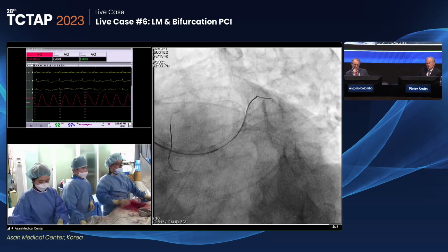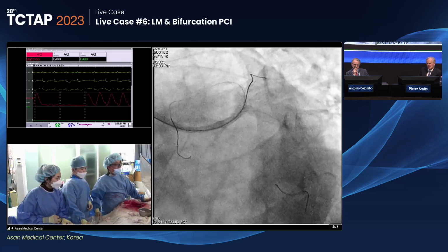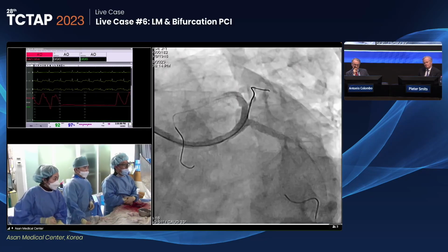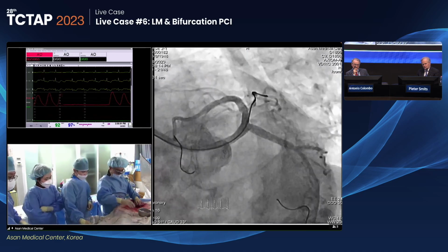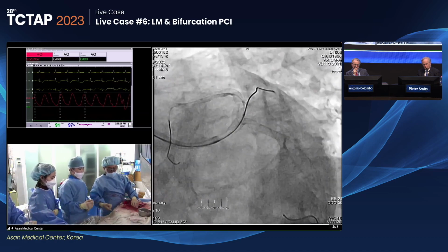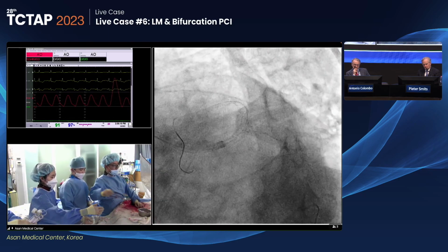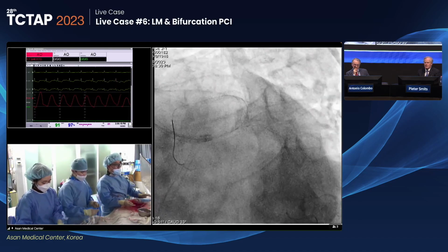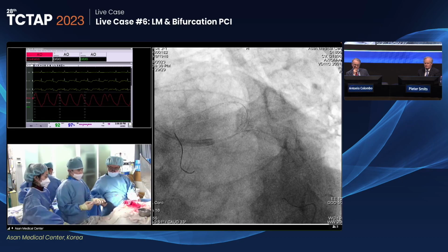The coronary angio, okay, angio ready. Vitals were stable. Okay, why did the real-time ECG show significant ST depression in the lead? We don't know. The patient is now stable. We removed the much stronger wire over here, and this is the Gaia First wire. Flow was fully restored and the patient's vital status is stable, and then we will check the final IVUS.